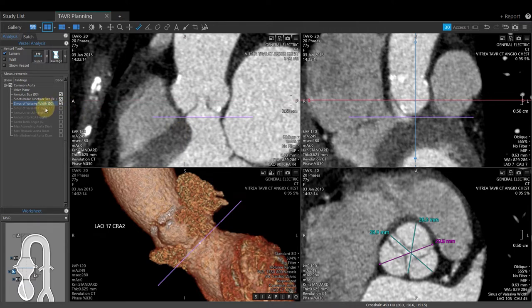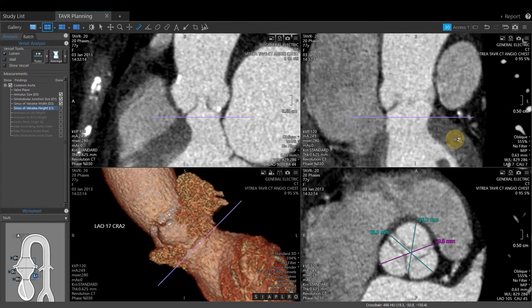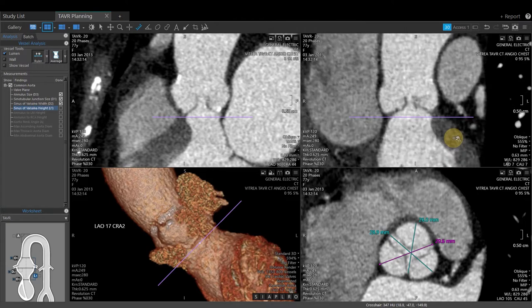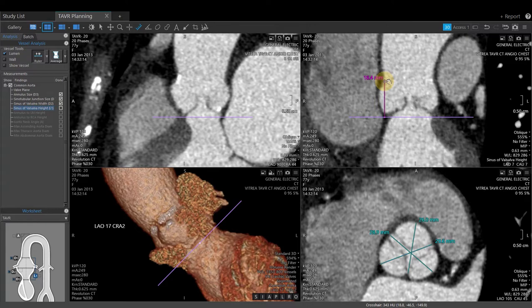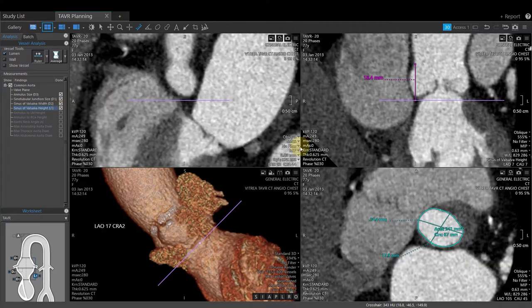Next is the sinus of Valsalva height. Left-click to activate, then roll the center wheel to view the sinus. Single left-click to measure. This is an optional measurement that many users skip. If you do not need it, skip it on the list and proceed to the next one. If documenting this, be sure to click Done and take a snapshot.